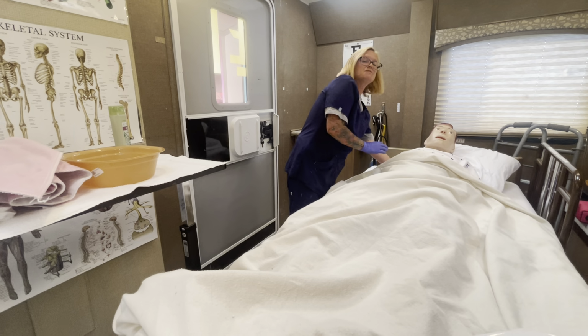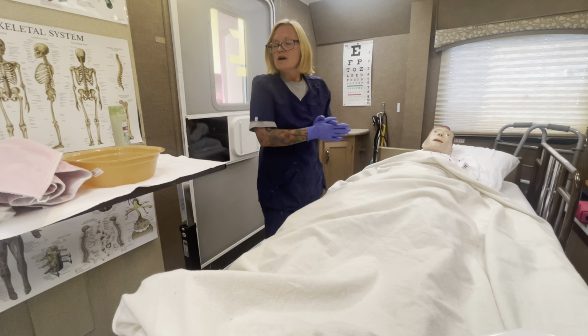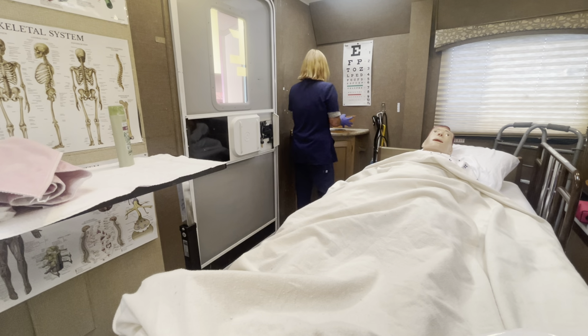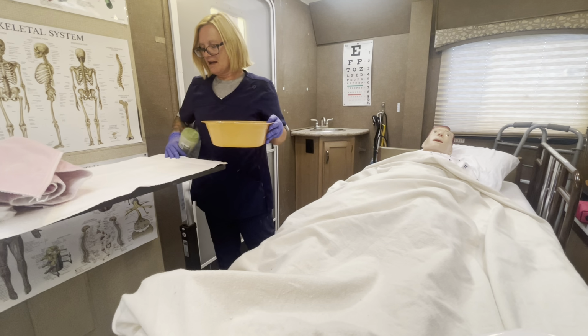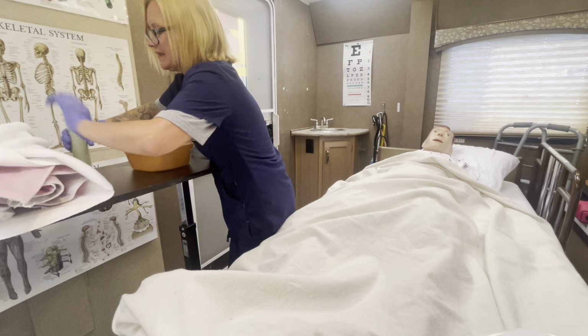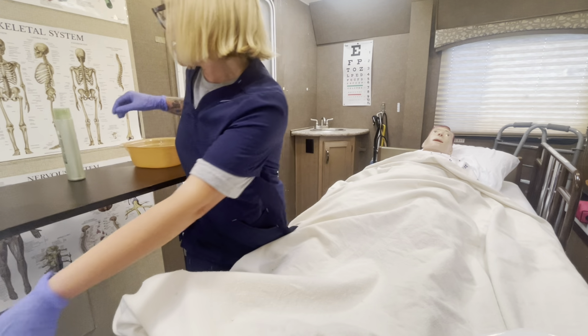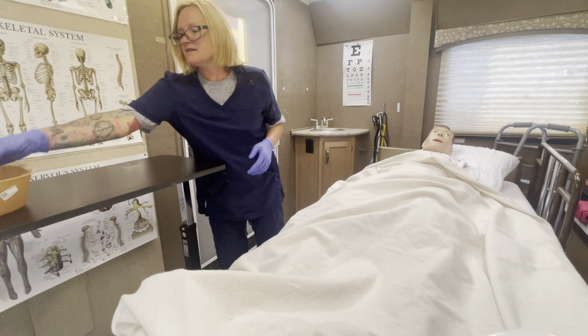I'm going to ask Miss Smith if she needs anything or if there's anything I can get her. If she says no, then I'm going to go ahead and take my pan. I'm going to empty it. I'm going to run some water in it, rinse it out, and dump it back in the dirty area. I'm going to take my linen that was used, and I'm going to place it in the dirty linen utility area, which usually you'll just have a little rug. I'm going to put my supplies back.